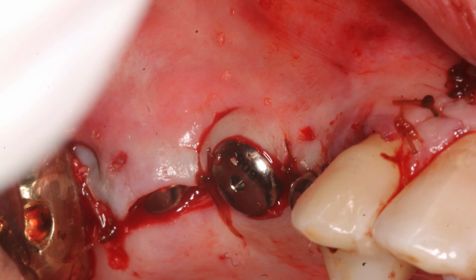And now the suturing is well on its way. You can see the vertical closure is pretty decent. And as we get back, we kind of ponder, should we change the healing abutment to something a little bit taller, which would make things easy? But in this situation, we decided to make this a learning experience of suturing technique.